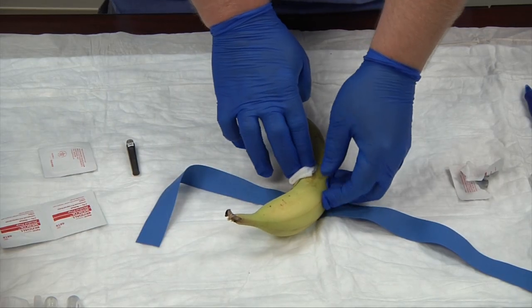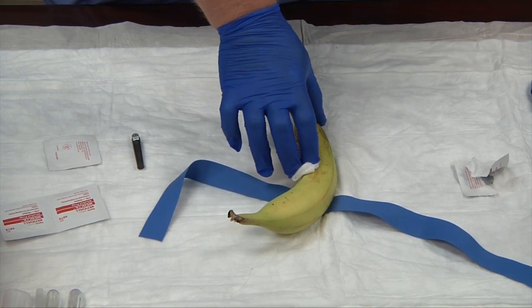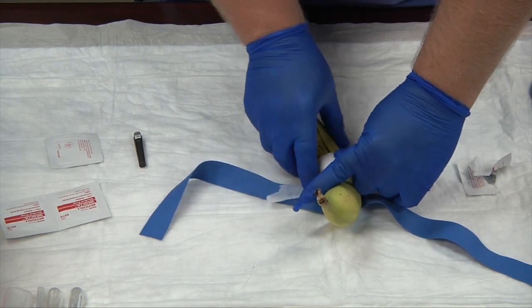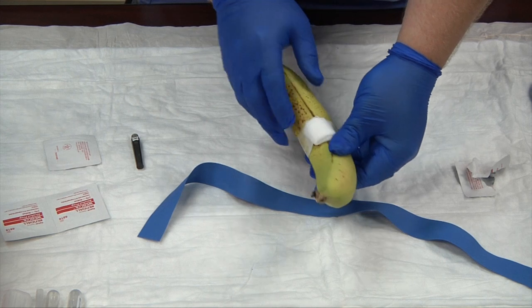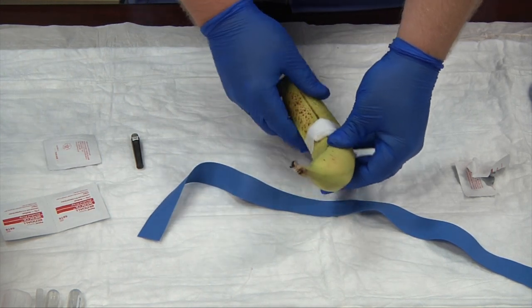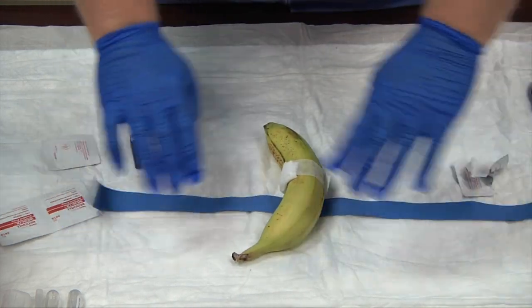Hold direct pressure on the site for a few moments. With your tape already torn and ready, bandage your patient — make sure you have a good tight seal, tight on the bottom and tight on the top. And that's how you can practice doing a phlebotomy blood draw on a banana.